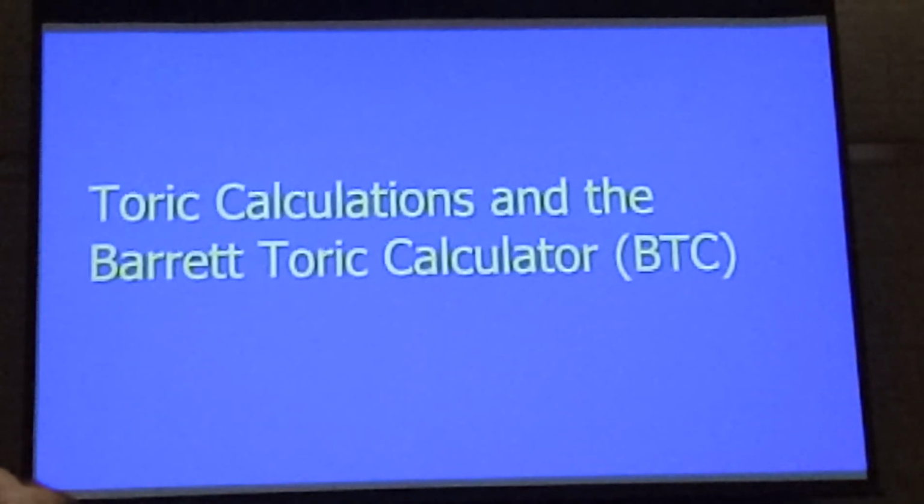So now, having said that, for the sphere, I would say that today, many of us in this room, Dr. Chi, Dr. Pham, we implant 80% of our patients with a toric IOL. Far more than a spherical IOL or a non-toric IOL. So I always start by using a toric calculation.